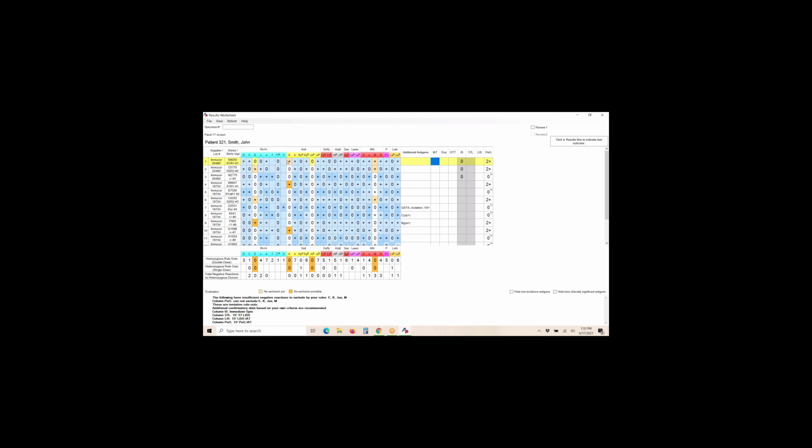The light orange, you're going to see, well, why isn't it saying the K is there? There's a reaction. Well, because M has not been excluded yet. We do have this line that Alan told you guys about, you're going to need to pay attention to, and you probably should.